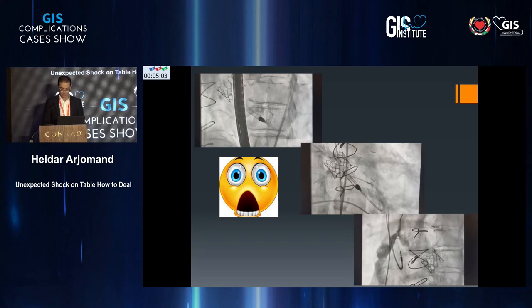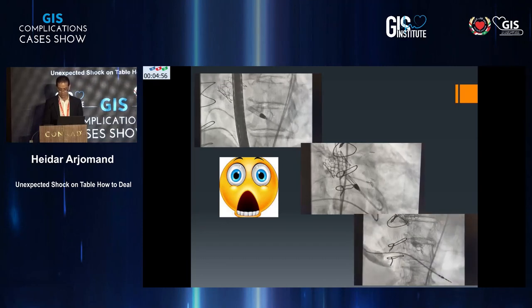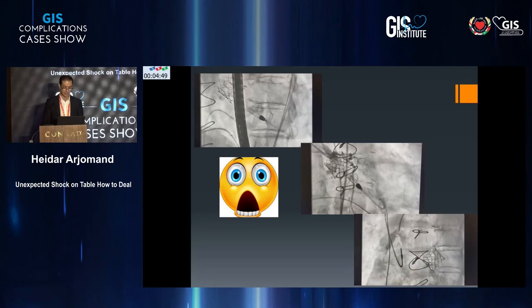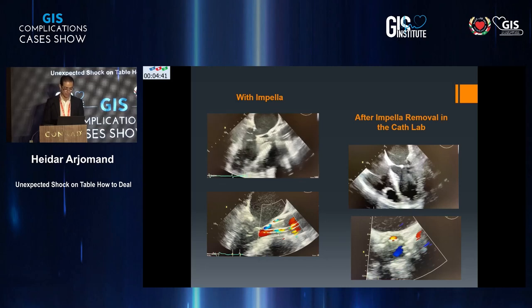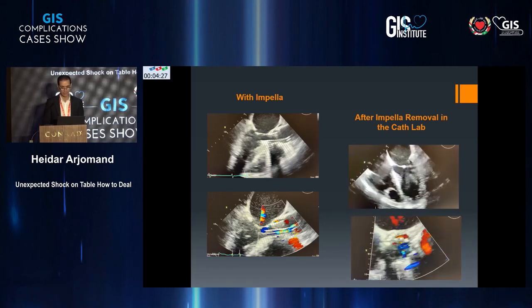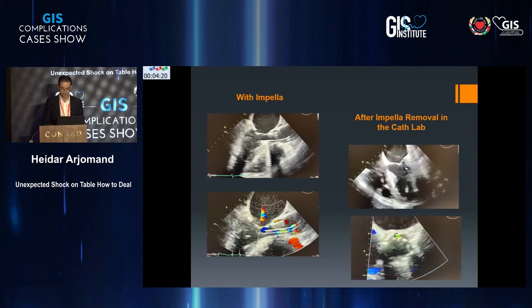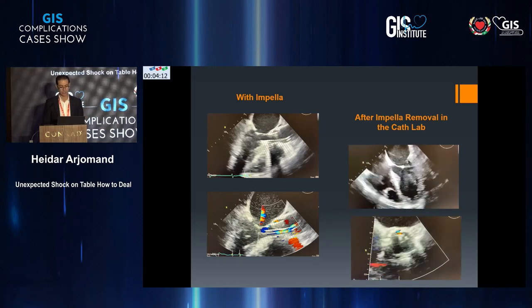We did take a picture of what is left from the left main. I didn't show you before, and this is a picture from the vein graft, significantly aneurysmal with minimal distal filling of the right coronary artery system. This is a TEE picture with the Impella in place. This patient actually had the Impella for about 1 hour in the cath lab, and the hemodynamics got restored to normal with discontinuation of the vasoactive support. And actually, we did remove the Impella in the cath lab after confirming that she would not need support any longer by decreasing the Impella support.